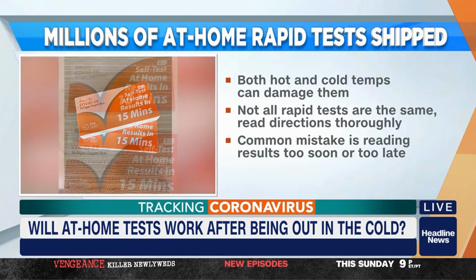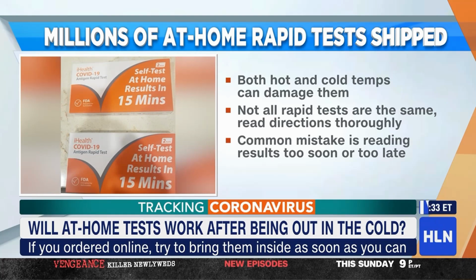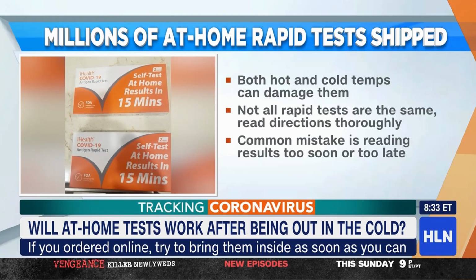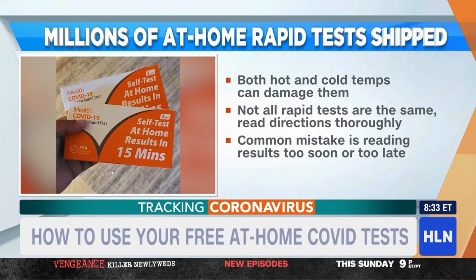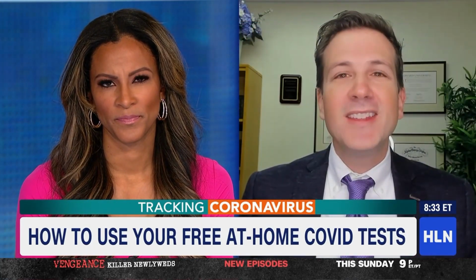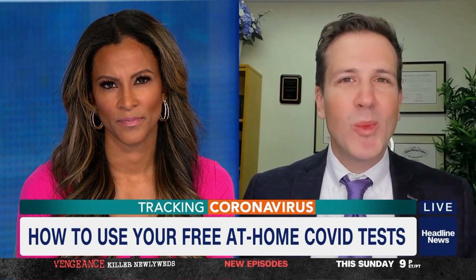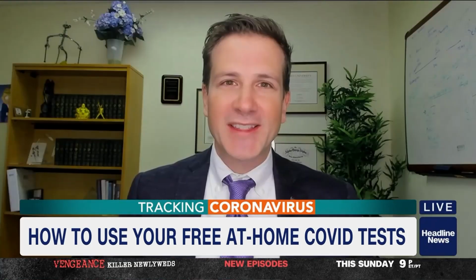And what about how you swab? You're swabbing your nose or your throat, because there's been mixed experiences in this. What's going to give you the best result here? Yeah, people have been talking about swabbing the throat in the midst of the Omicron wave. Really no strong data to suggest that that's a great idea. So the recommendation, stick with what has been tested and shown to be accurate, which is those nasal swabs.